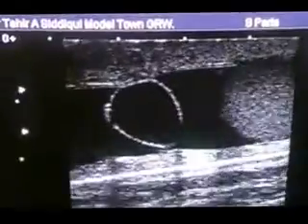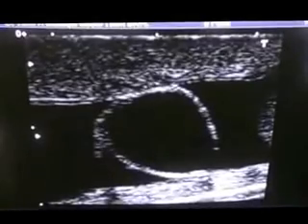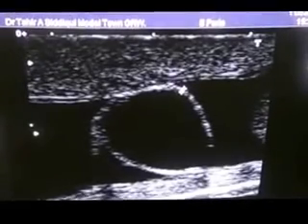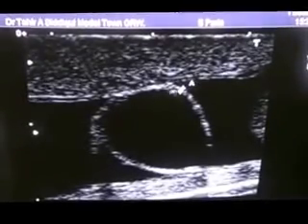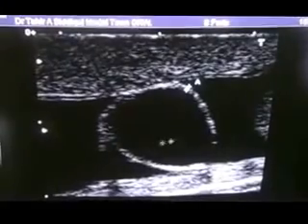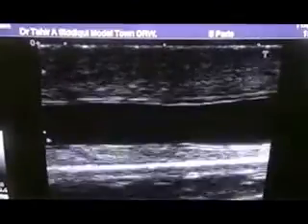Let's magnify a bit. You can see its wall measures approximately 0.5 mm. It is internally clear of any echoes, though at times we may see low-level echoes suggestive of sperms. This is fluid, and there is also fluid surrounding the cystic area in the right hemiscrotum.